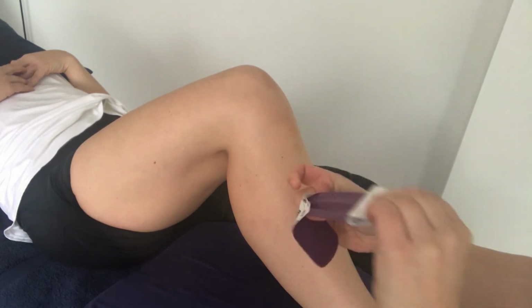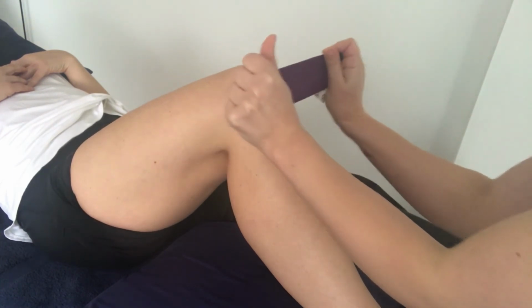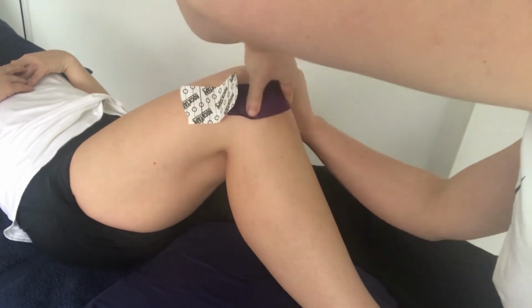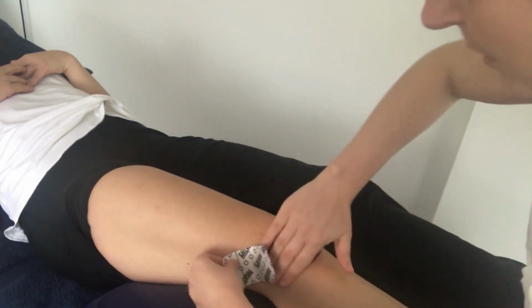And once you have finished the quadriceps inhibition, we can start offloading the tendon at the patella, and you can do this on its own also. So you break off the paper at the centre of the tape, and then you want a heavy tension on the tape. And you want your anchor to go in and upwards towards the patella. Stick the section down in the centre and then relax the knee to apply the anchors on both sides and then rub to stick the tape.